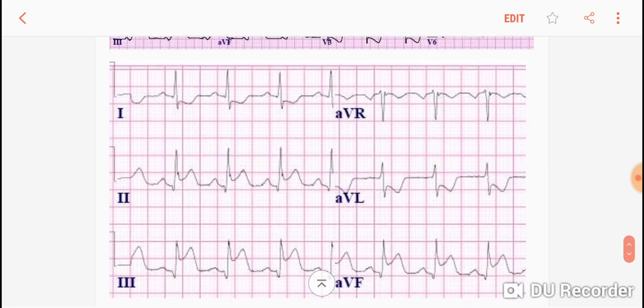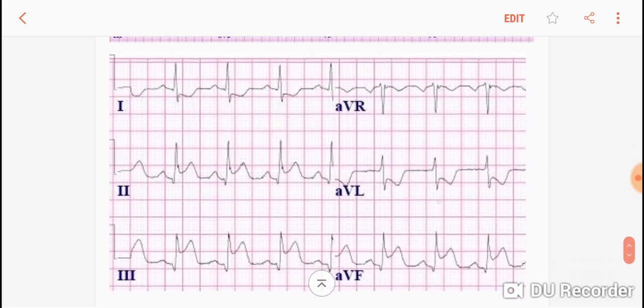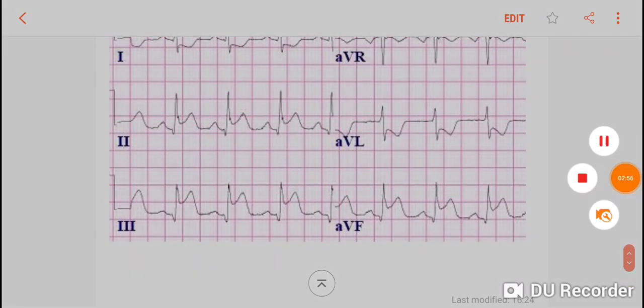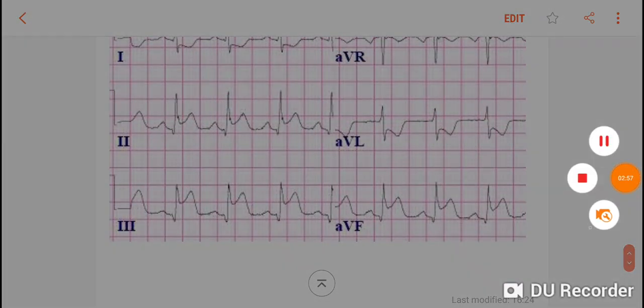This is an example of an inferior wall MI, where leads 2, 3, and AVF have ST elevations. I hope you can now better diagnose STEMI, or ST elevation MI.